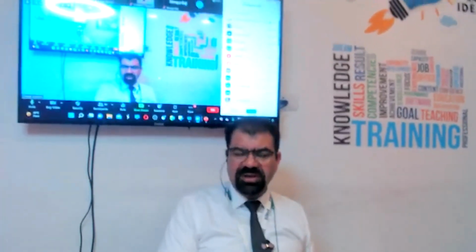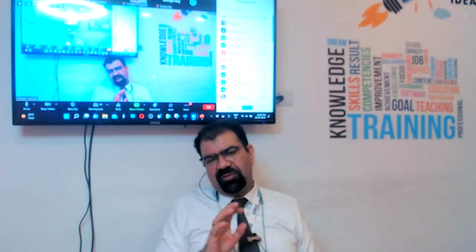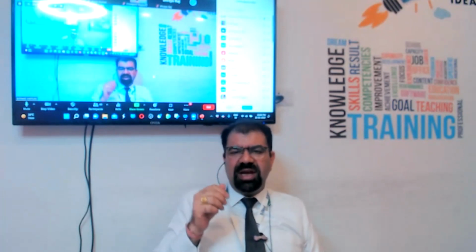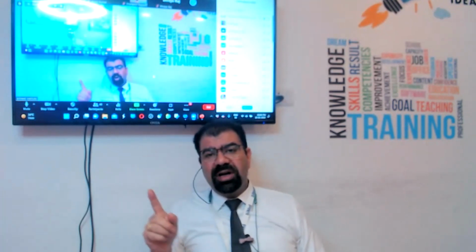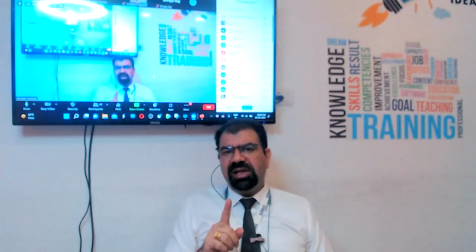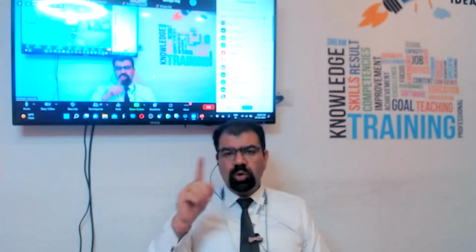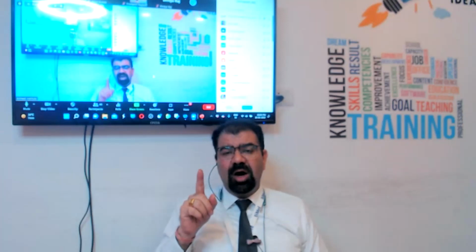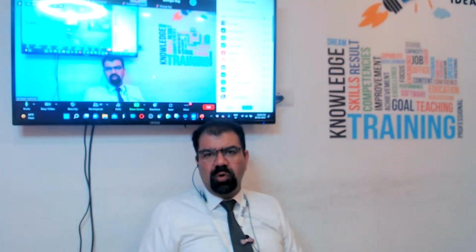Now, the point is you have to understand what for you are taking a ductus venosus flow in early pregnancy, I mean in an NT scan. Are you taking it in a level 1 scan to rule out or to see for any fetal acidosis? Yes or no? Think. Whosoever is thinking yes is wrong. We are not taking ductus venosus in NT scan to see for any fetal hypoxia or any acidosis. Big no.